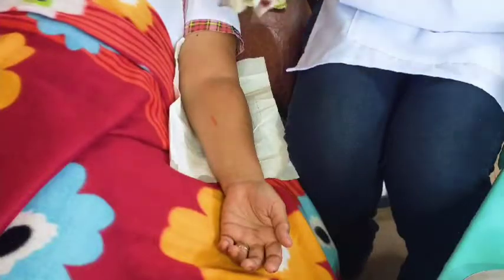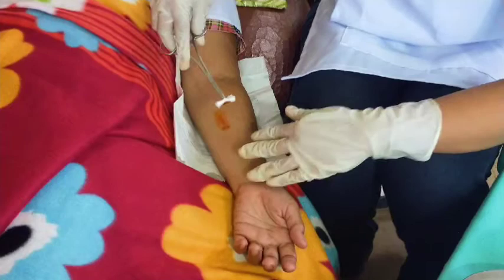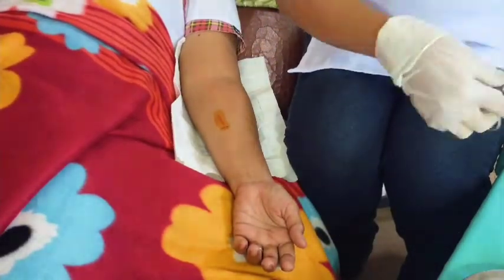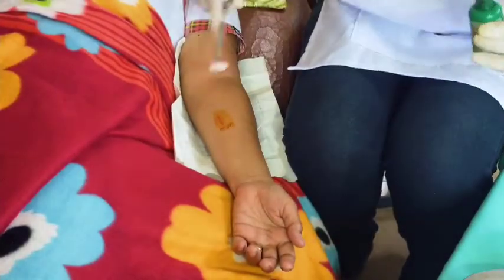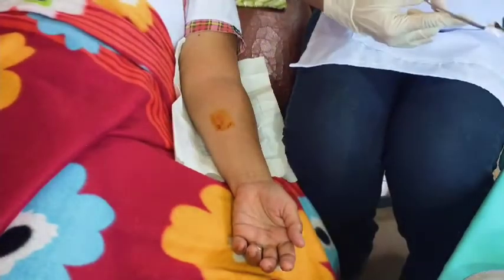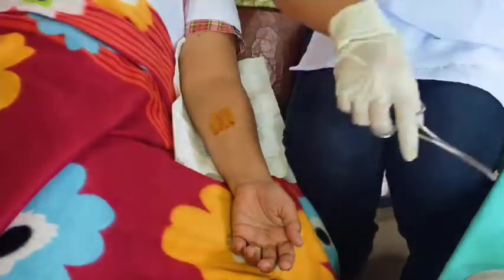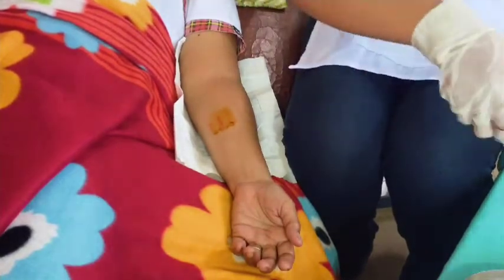Now, we're going to clean the wound. So, we're going to clean the wound from top to bottom and from the center to outside. Following this pattern, we're going to use new gauze for each wipe and placing the used gauze in the waste receptacle. Or, alternately, we can spray the wound from top to bottom with commercially prepared wound cleanser.